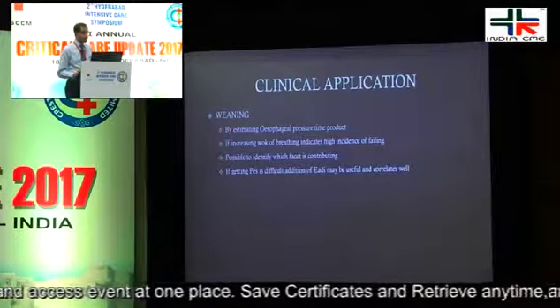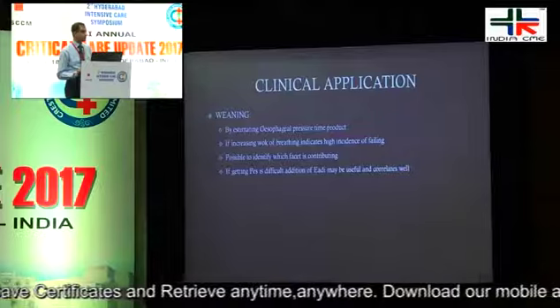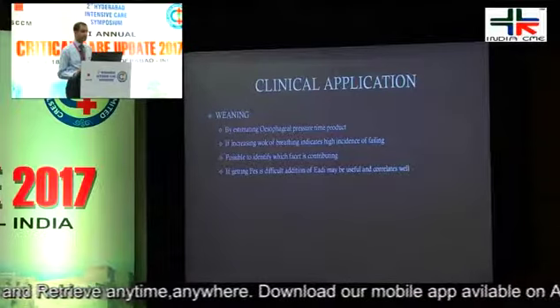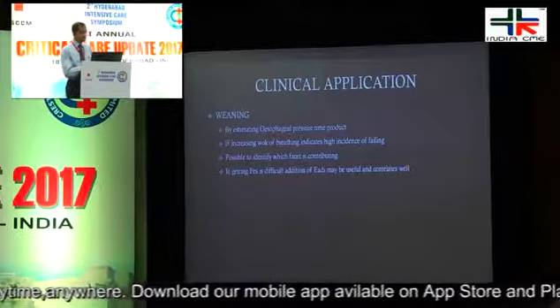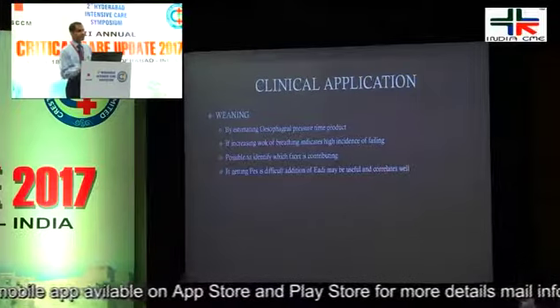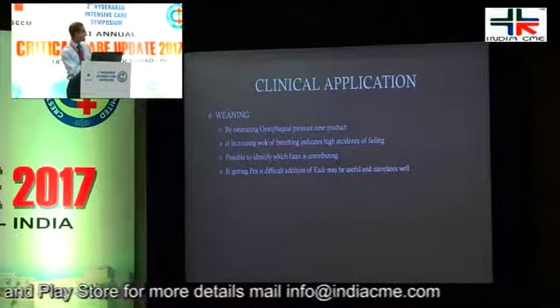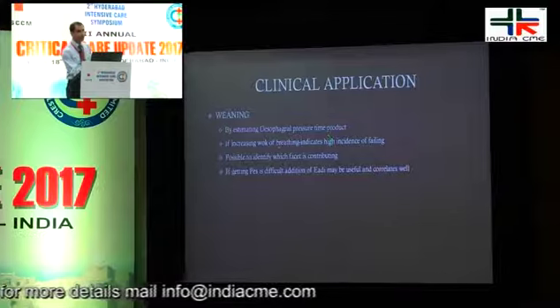Weaning is yet another indication where the esophageal pressure monitoring system can be used. One is, as I said, the work of breathing assessment can be done with the help of this system. When you put these patients on a spontaneous mode, the esophageal pressure time product will give you an idea of the amount of work being done.